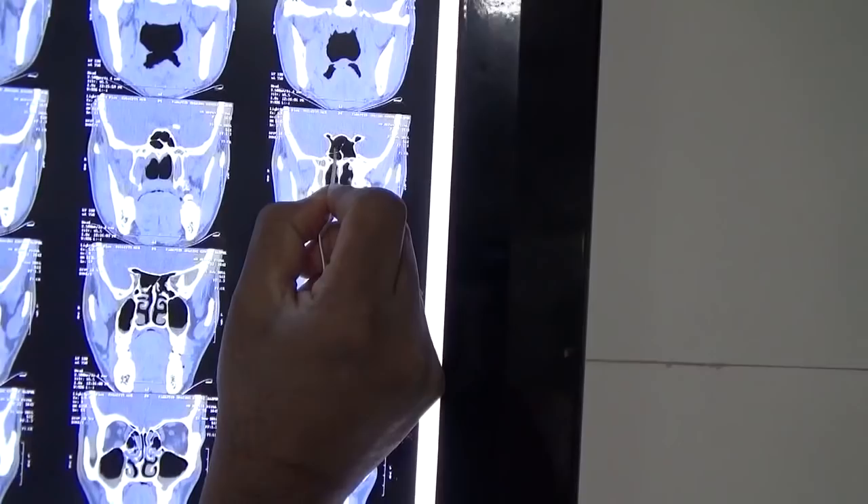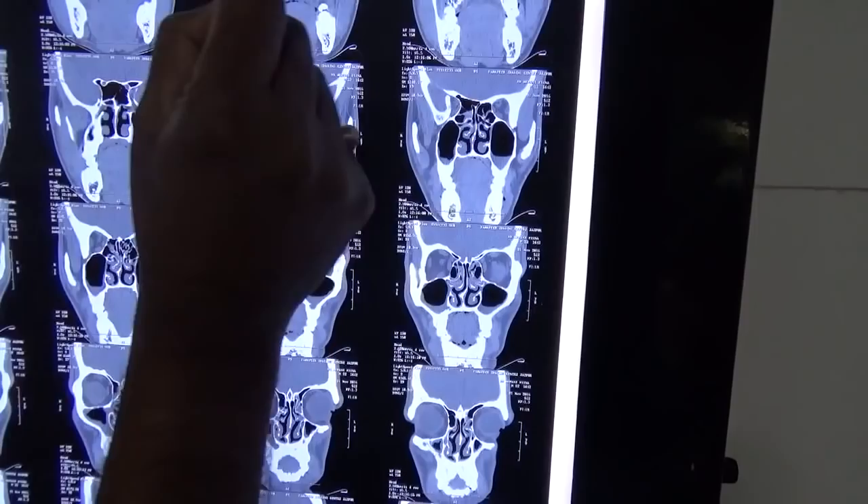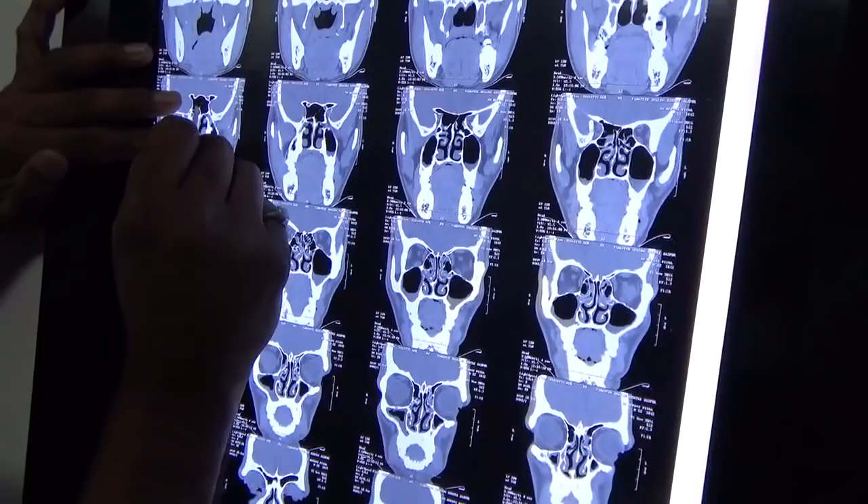This is the vertical septum, dividing the right and left sphenoid. The horizontal septum — horizontal septum, horizontal septum — so this is an Onodi situation.